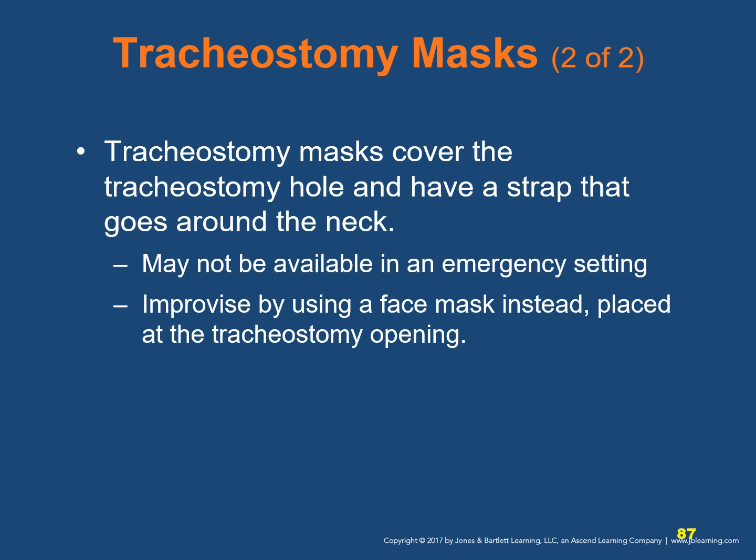This is what I was just talking about. Make sure you remember that the tracheostomy mask covers the hole or stoma in the neck and has a strap that goes around the back of the neck. These aren't always available, but you can use a face mask placed at the tracheostomy opening.